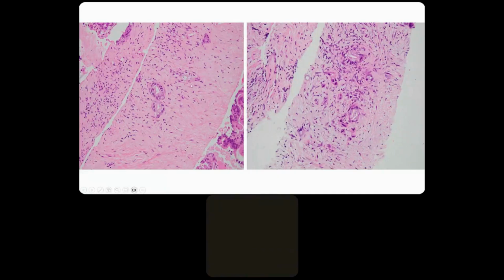They are irregularly and haphazardly arranged. None of these four look alike. And when you get these angulated ducts with poorly formed lumina, that is a dead giveaway for a pancreatic adenocarcinoma. And if you look very carefully, you'll see that the cytoplasm in this particular duct is clear, and it has this foamy appearance, very characteristic, again, of a pancreatic adenocarcinoma.